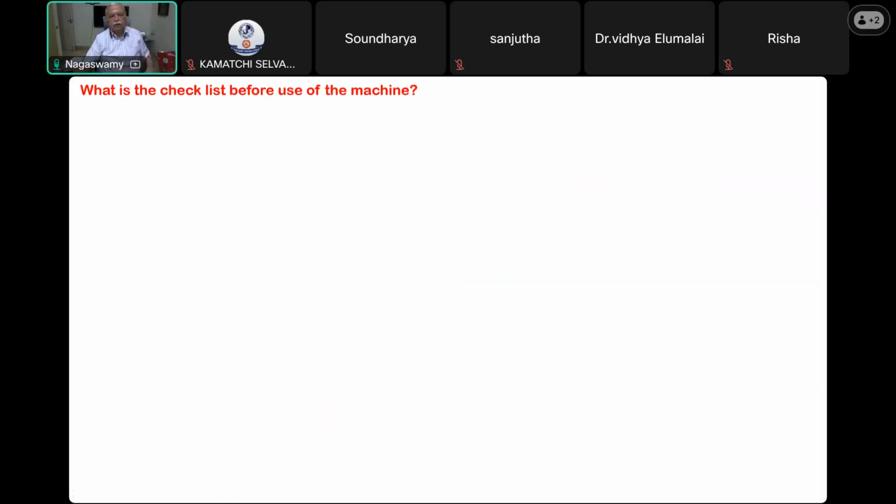This is another question that will be asked. I will go through that quickly. Check availability of working suction, ambu bag, and defibrillator. This is the first answer that you give.